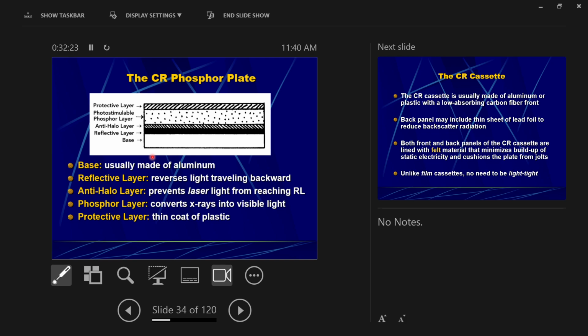You can see, I don't know how well you can see, but there are scratches on this plate. As these plates get scratched over time, the phosphor, the working part of this, gets removed. And every time this plate goes in and out, and an image is brought up on screen, you see a big fat scratch running across your image, because the detecting part of the plate gets scratched away over time. There are rollers that have to bring this thing into the processor and out of the processor. It's pushed in and out thousands of times. All of that means that the protective layer and the usable phosphor layer will wear down over time.